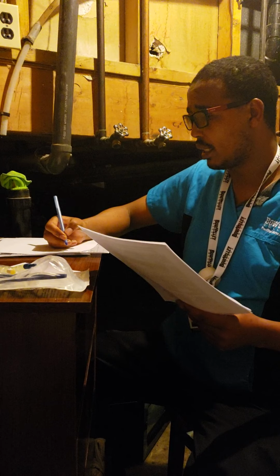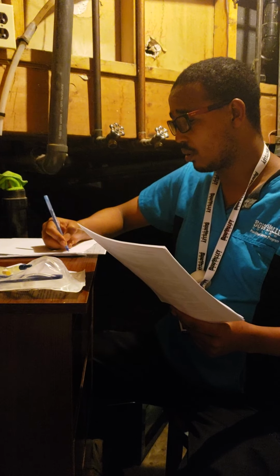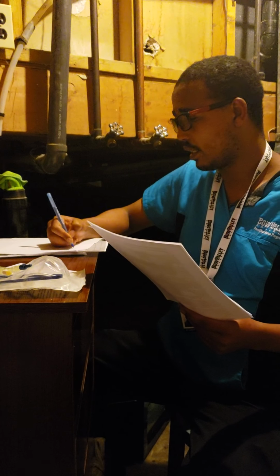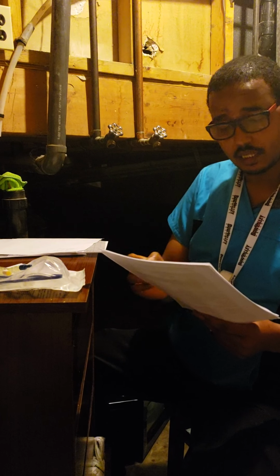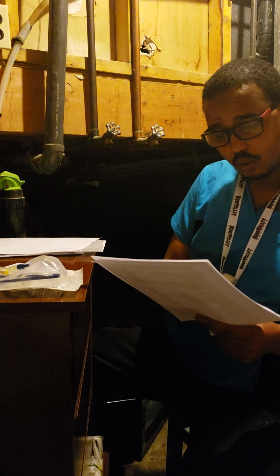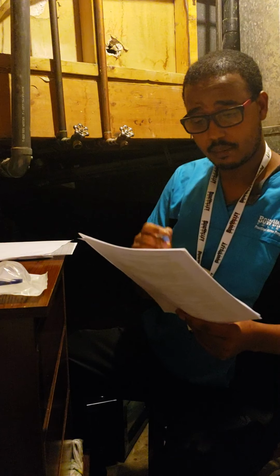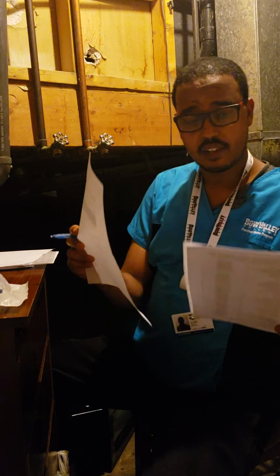Okay, so for reconstitution, the medication availability is 4 milligram per ml, and the doctor's order is 8 milligram. I have to calculate the ml required to administer. So 4 milligram per ml equals 8 milligram per x, cross multiply, and I need 2 ml of dexamethasone. So that is the amount I'm going to administer. I have to dilute it in normal saline. The solution that I'm going to use is normal saline, the amount is 50 to 100 ml mini bag over 20 to 30 minutes. So I've done that one.